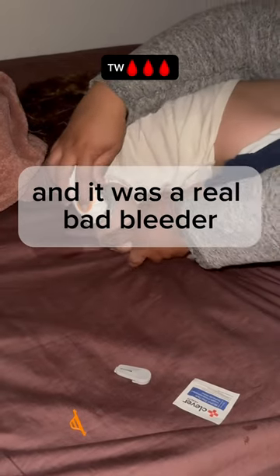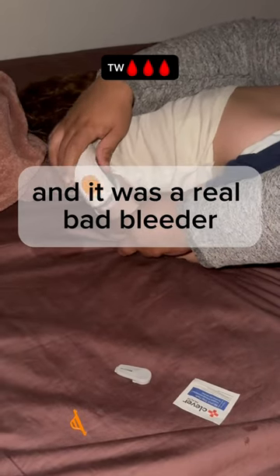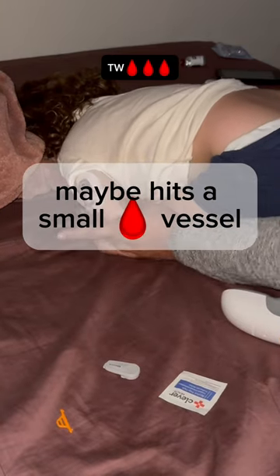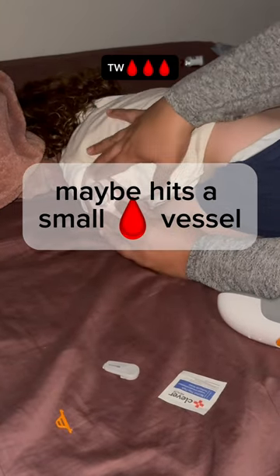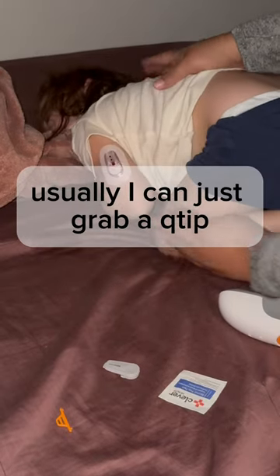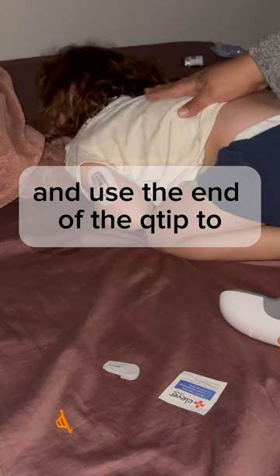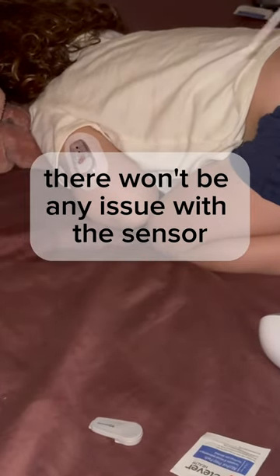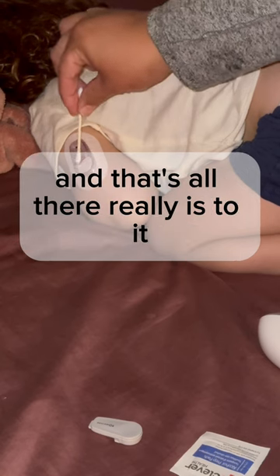I changed out a Dexcom sensor and it was a real bad bleeder. I think this may happen because the Dexcom sensor hits a small blood vessel and makes it bleed a little bit. Usually I can just grab a q-tip and use the end of it to soak up the excess blood so there won't be any issue with the sensor — and that's all there really is to it.